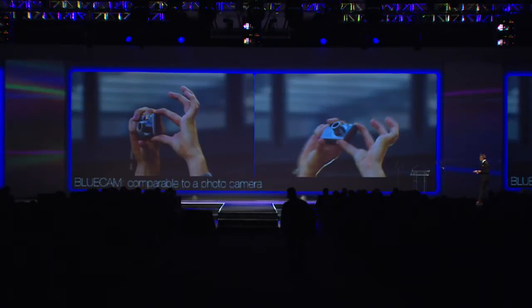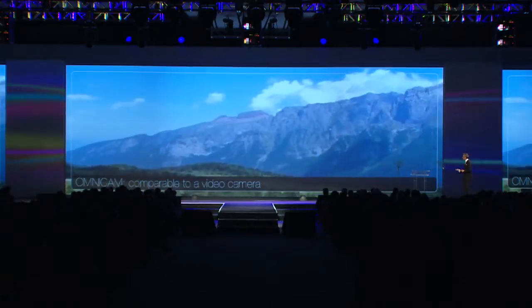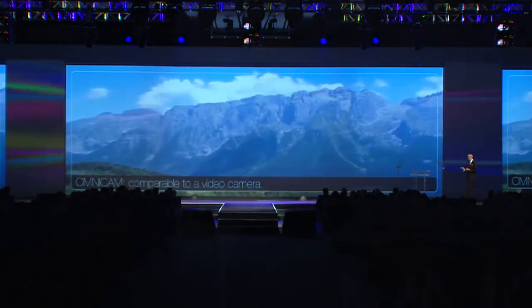So again, the blue cam is comparable to a photo camera. We are doing a photo and we are checking our image or our photo. The OmniCam camera is like a video camera. So many single images are stitched together and we have like a small movie. So this is the basic difference between the OmniCam and the blue cam camera.